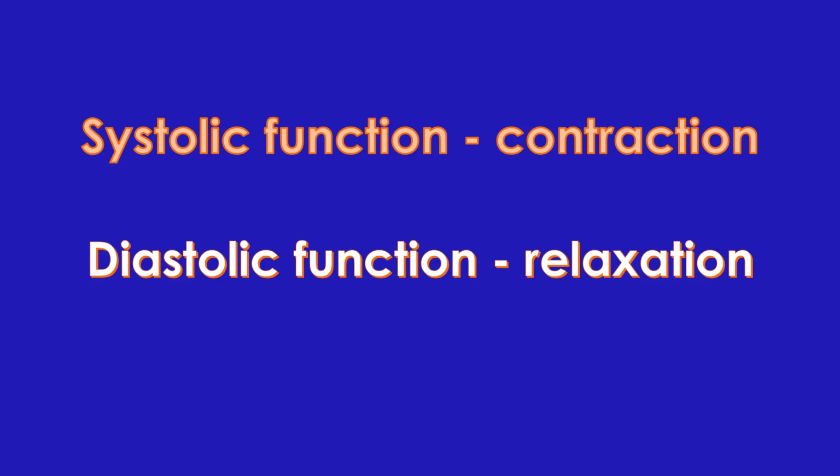An ejection fraction below 50% is considered below normal. The lower the ejection fraction, the poorer the pumping function of the heart. A normal left ventricular ejection fraction is usually reported as good left ventricular function. If it is severely impaired, it is noted as severe left ventricular dysfunction. When the left ventricle is stiff and relaxes poorly in diastole, it is reported as left ventricular diastolic dysfunction. Left ventricular diastolic dysfunction is quite common as age advances.